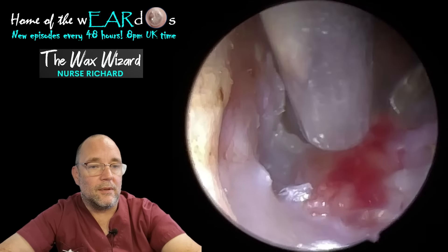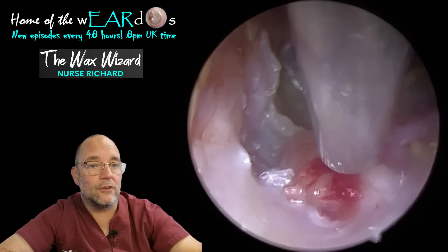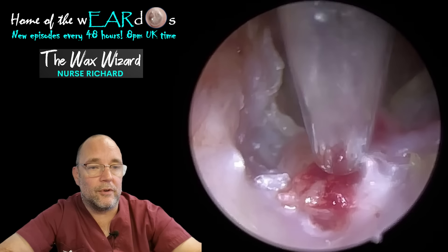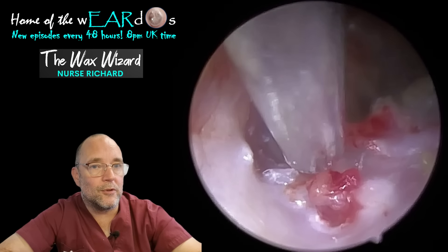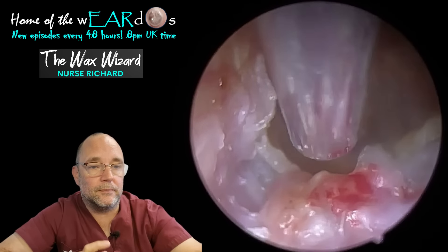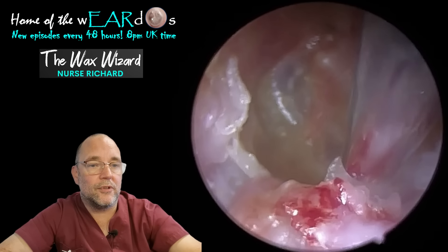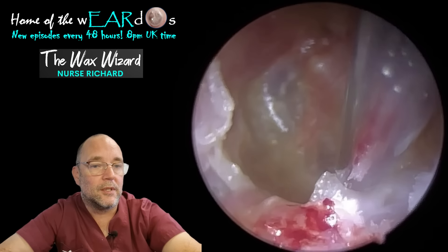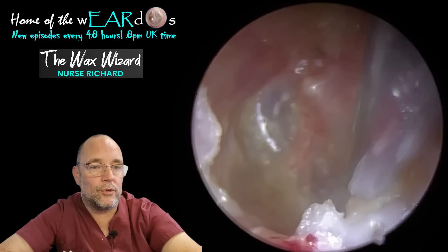I'm just going to get that little bit of white skin there. This is obviously the fine end tube, as the majority of this was done with - and lift that up. What's interesting is you will see the floor of the ear canal where it actually was. It's quite extensive, this crater here. If you see me hovering around there, it's because I'm trying to figure out where I need to go, because it's kind of hard to know whereabouts you are - which is bone, which is dead skin, which is the floor of the old ear canal as it was. You can see - just to the left - that is definitely exposed bone in there. And just to the left of the tube now, you might see this little flap of pink skin just lifting up and down - that is where the floor of the ear canal was. So it's buried deep down underneath that.